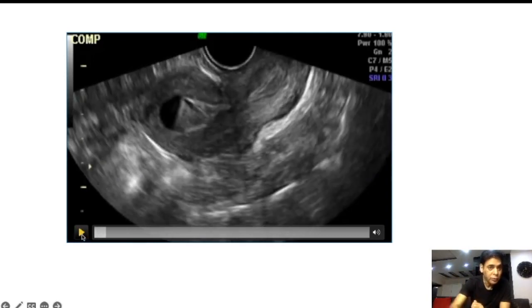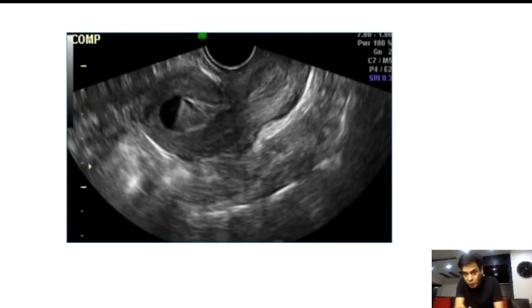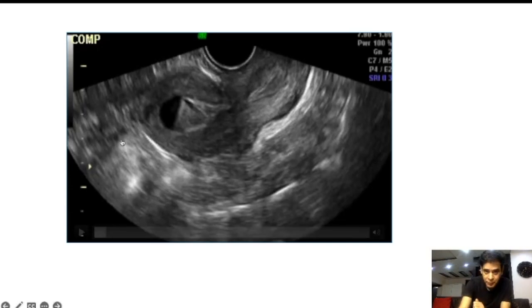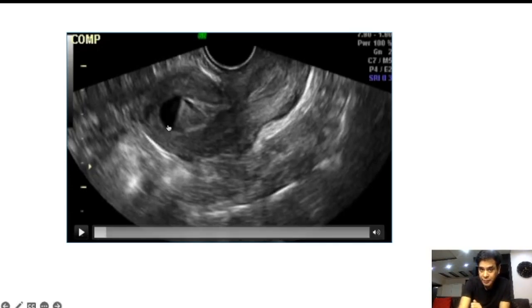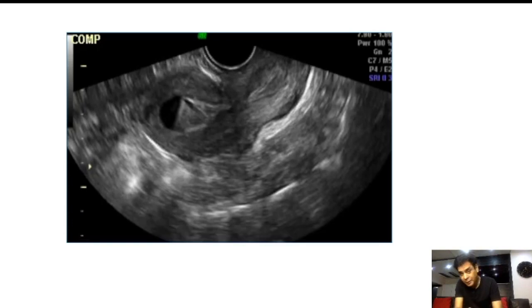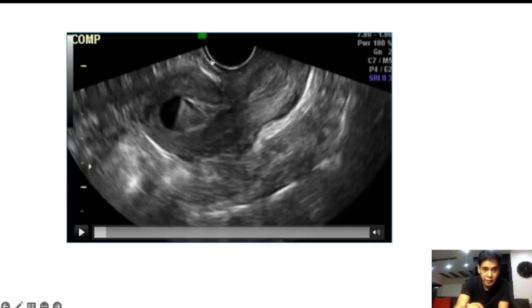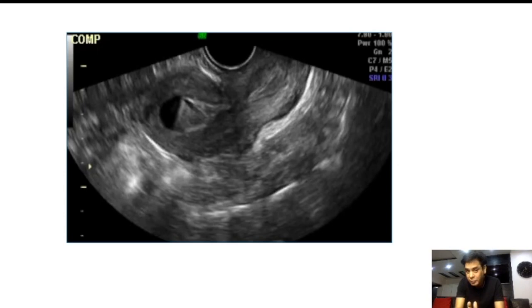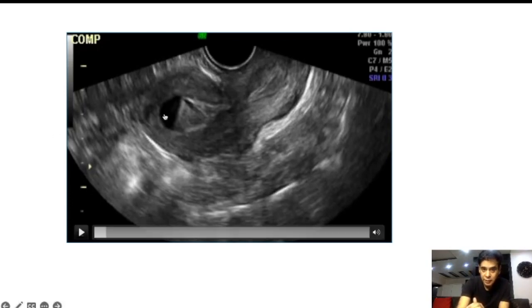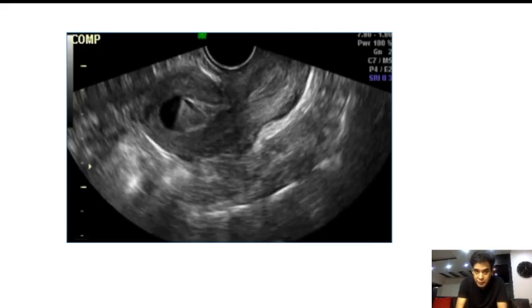As I play the video, I can see that the thing which was appearing like a sac is nothing but fluid collection in the uterine cavity. The second thing I can make out is that this fluid collection has a level — this is referred to as a fluid-fluid level. Fluid-fluid level means there are two different densities of fluid: the lighter, darker one here and the denser one here. This has internal echoes.